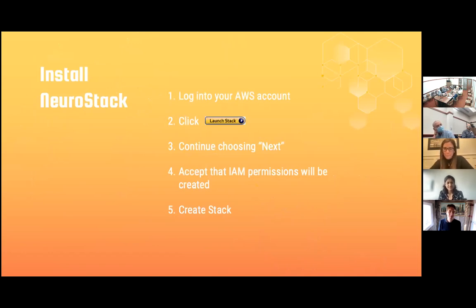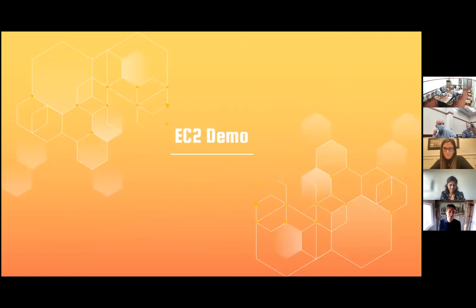All right, before I get into that, you can see the way we were working with this before was usable for small amounts of data, because I could copy data in, do some work with it, and copy data out. But when I was working on this project with the ABCD data, I thought, am I going to do that for thousands of imaging files? And even if I scripted it, it goes one at a time.